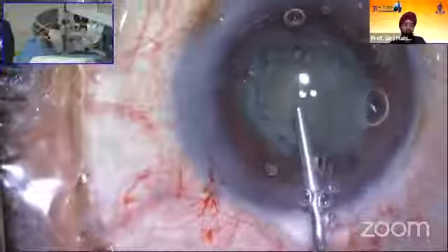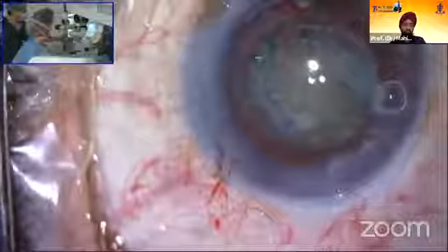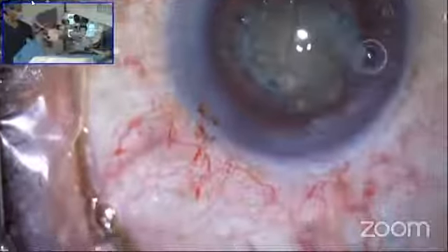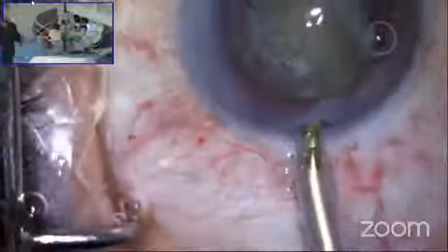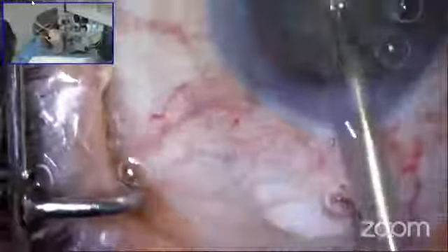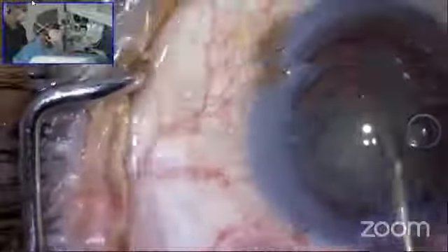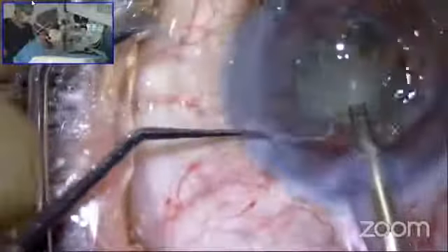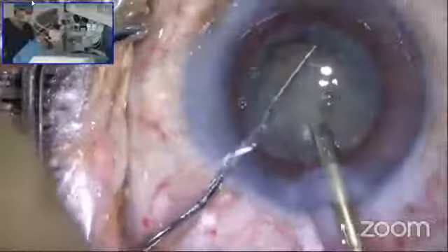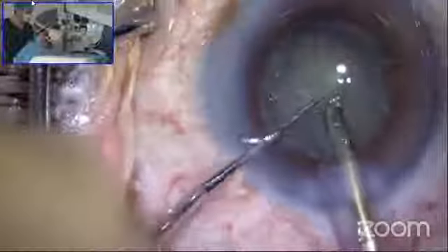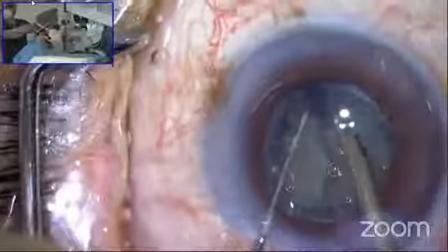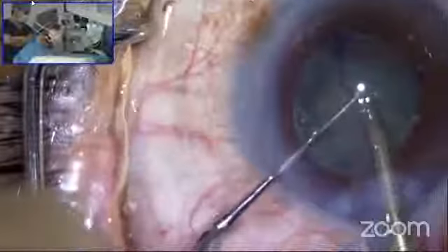This is a 20-gauge needle. The settings are: 370 vacuum, 40 power, WhiteStar, and 34 as the aspiration. This is the bent Kelman tip. I use a chopper which is sharp-cutting and inside-cutting. RP has done a wonderful job making his chopper for hard cataracts. You can see going in how easy it is — it's already pre-chopped. You really don't need any energy. Rotation is also good.